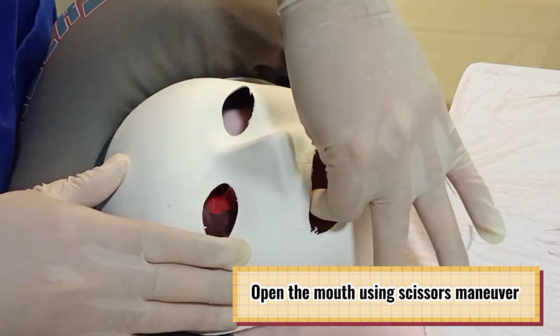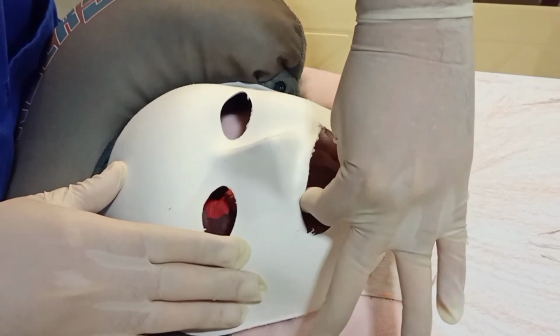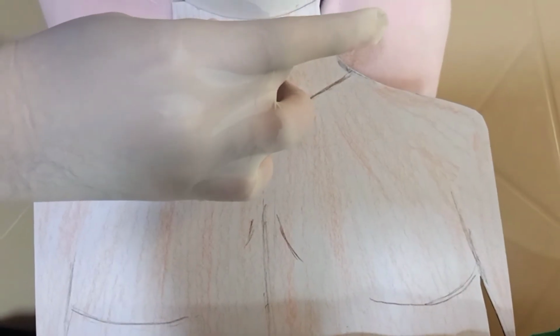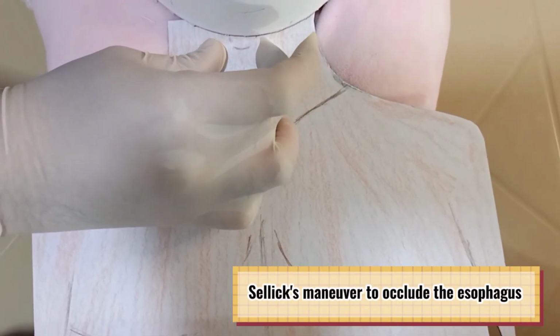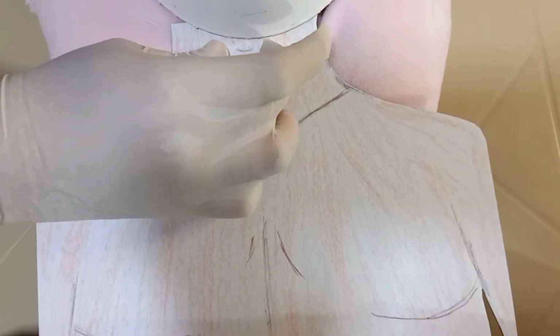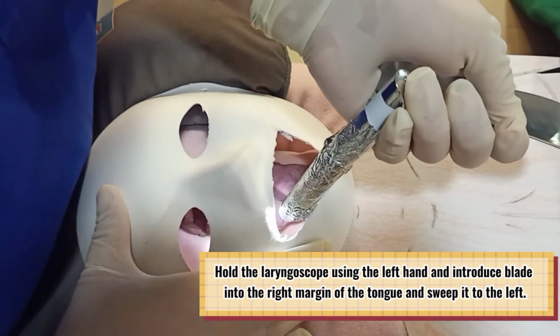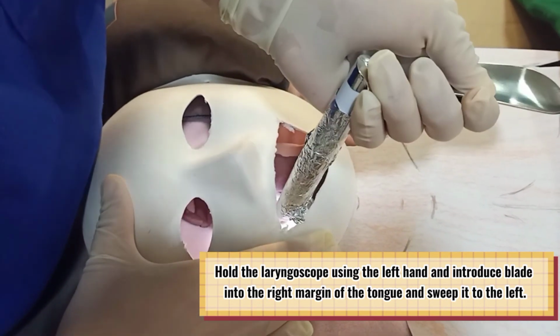The scissored thumb and index finger of the gloved right hand touches the right mandibular and maxillary premolars to open the mouth. Prior to intubation, you can also perform the Sellick maneuver by applying pressure on the cricoid cartilage to occlude the esophagus. Now to begin the intubation, hold the laryngoscope using the left hand with the 5th finger close to the hinge and the handle pointing right to the sagittal plane.